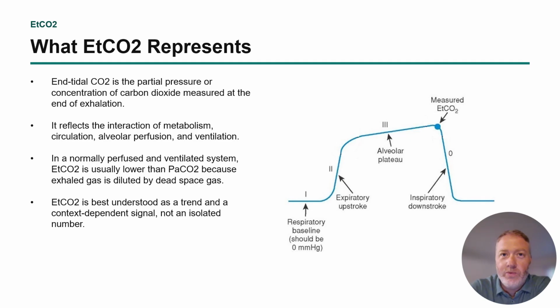So, my experience with end tidal CO2 is kind of hit and miss. A lot of times I don't find it very, very reliable. Certain end tidal CO2 things that we have in NICU, they're even less reliable in my opinion.